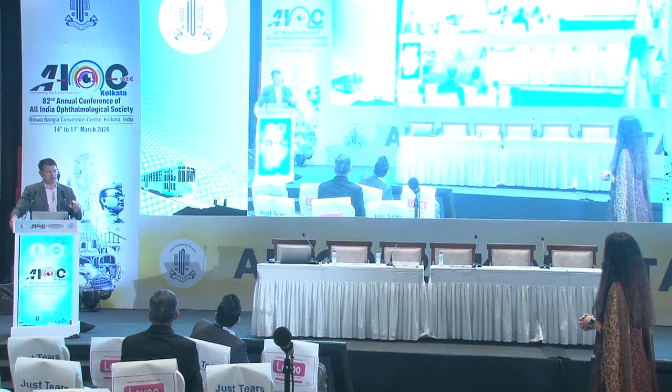In fact, when I'm teaching fellows and I teach DMEK internationally, I usually tell them don't do DMEK cataracts until you've done at least 20 DMEK. Do your cataract surgery first and go back into your DMEK a month or 2 later once the lens is fibrosed in the bag a bit, so you don't have to deal with that tendency for the chamber to shallow where you're trying to insert the DMEK scroll.